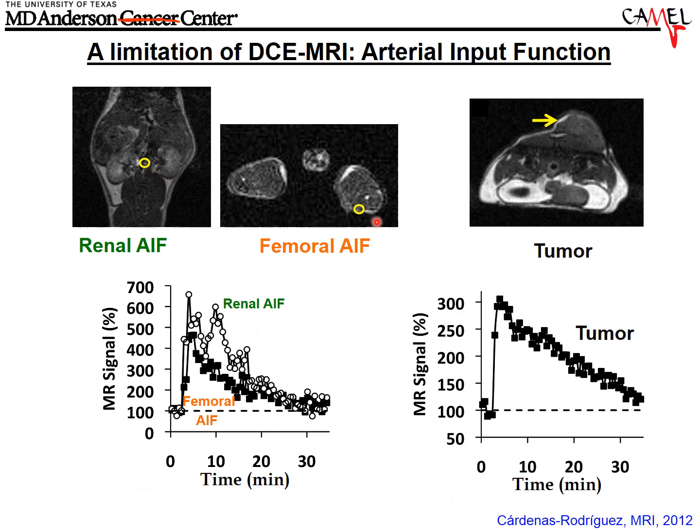You can lock down the legs a little bit better. I prefer that to get the femoral AIF. But still, there's motion there as well, and that little dot is very challenging to find in some legs. The pharmacokinetic profile of uptake and decrease after injecting a gadolinium-based agent in the tumor is really not too bad, but there's some noise there as well.